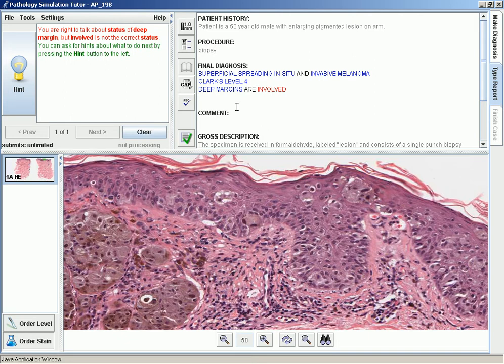So now, as you can see, different things are different colors. And you can also see it up here with what was carried over from the Make Diagnosis tab. Some things turn blue, some stay black, and some turn red. So let me explain what these different colors mean.